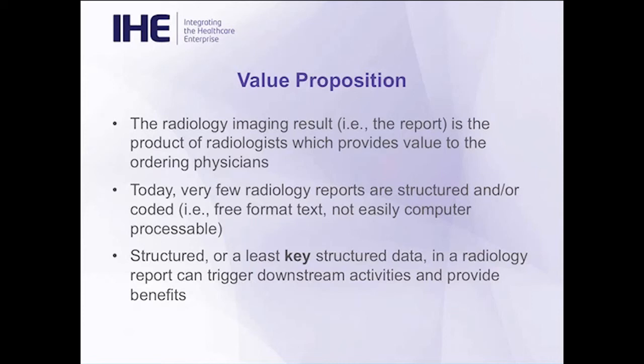We would like to move forward to more structured or coded radiology reports, and this is a first step. So the intent of this profile is not to structure the entire radiology report, but to bring forth certain pieces of information so that we can automate processes downstream and trigger processes downstream using information in the radiology report.